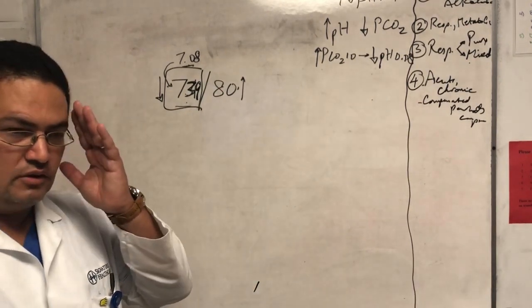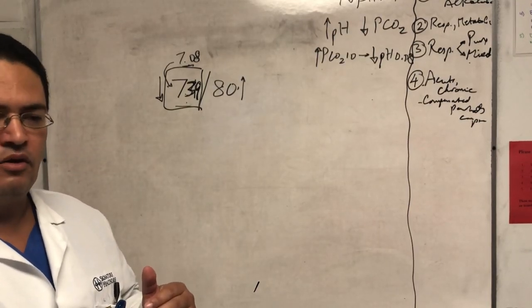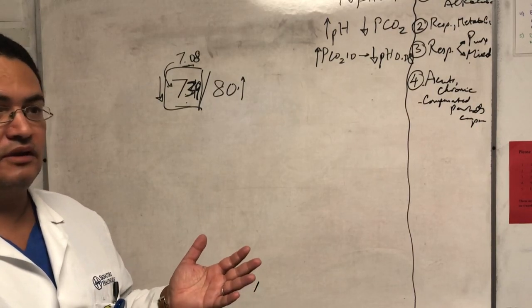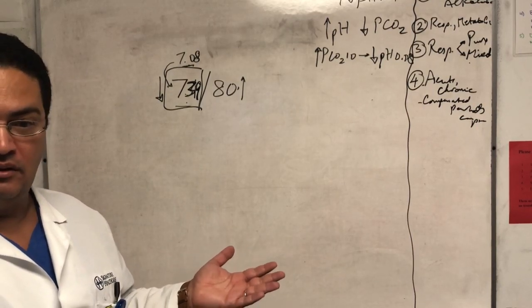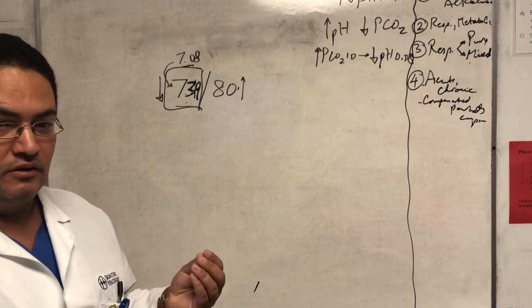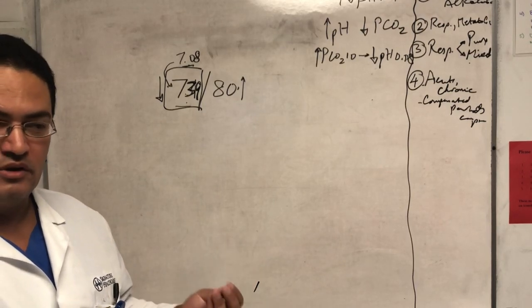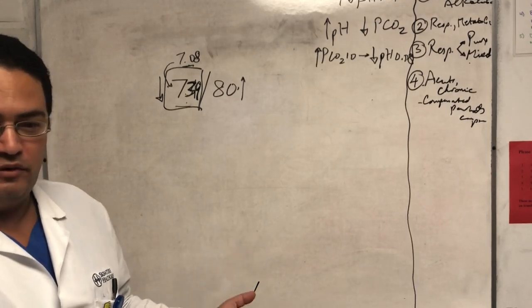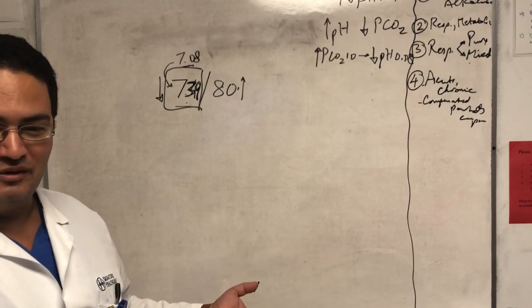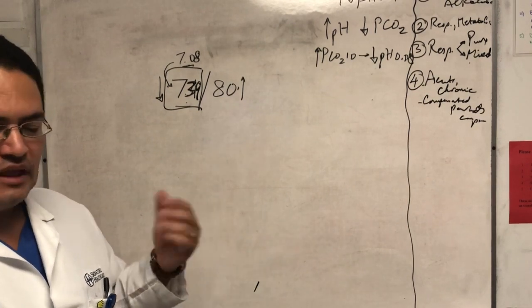But there is a lot of evidence for that. I see a lot of people who tell me, well, I have a COPD patient and he came in with a PCO2 of 65, and I hear the whole presentation and there's no pH mentioned. As if the PCO2 alone matters. A PCO2 of 65 could be worse than a PCO2 of 100, if the PCO2 of 100 is attached to a pH of 7.4 and the PCO2 of 65 is attached to a pH of 7.2. You know what I mean? It depends how acute it is, that's all. There's a lot of evidence.